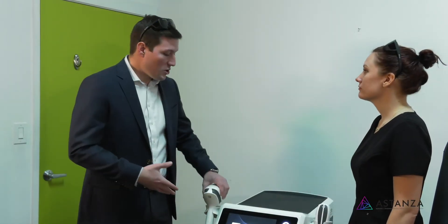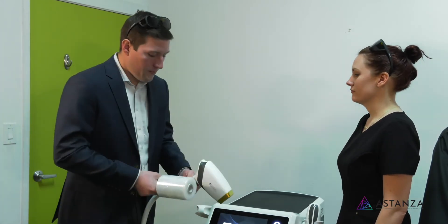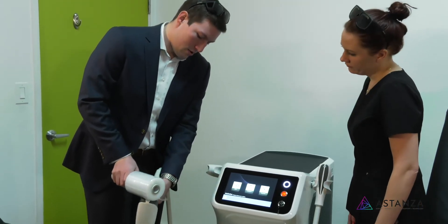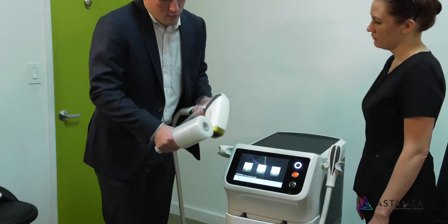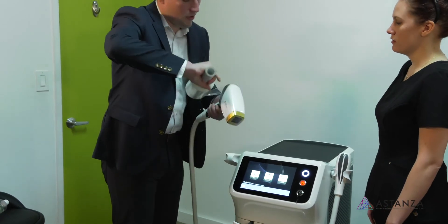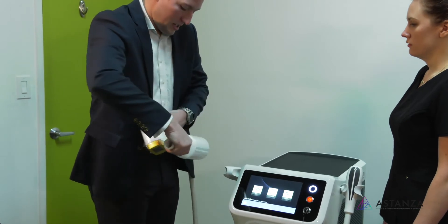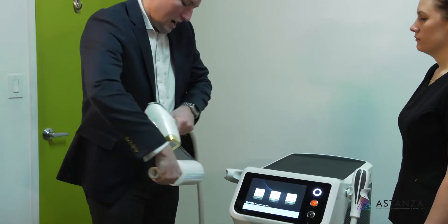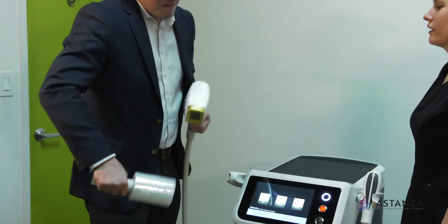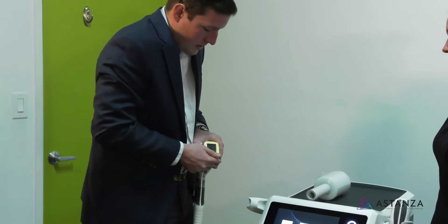To keep the handpieces clean, we use standard shrink wrap. Super easy to apply — pull a little sheet off and put your thumb right on the XL. Stretch it tight, come around the front, wrap it around the back. This prevents getting gel all over the place. I usually wrap it down the handpiece a little bit because I get a little messy — just want to straighten it out, and you're ready to go.